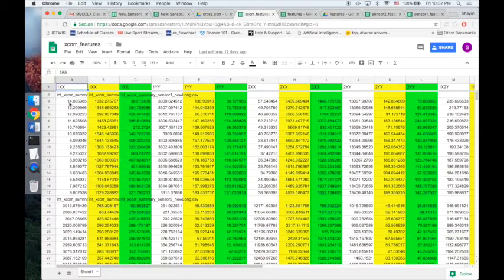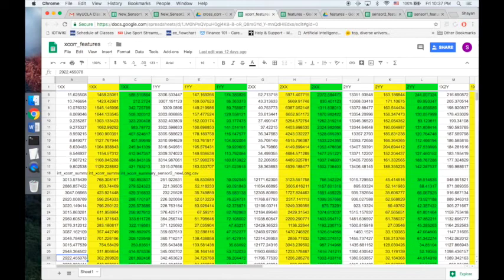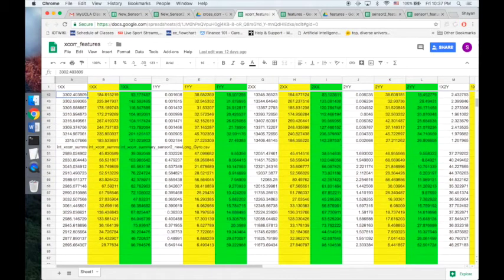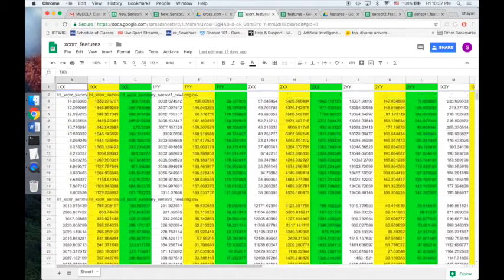1xx is the autocorrelation of the first file, 1yy is the autocorrelation of the second column for the first file, and similarly you can follow the nomenclature. Now this data here was observed in order to find a pattern that can be used for classification. We observed the autocorrelation and cross-correlation for axes of motion of acceleration y and acceleration z. After the observation, it was found that the autocorrelation for acceleration y is distinct, and that was one of the features extracted.